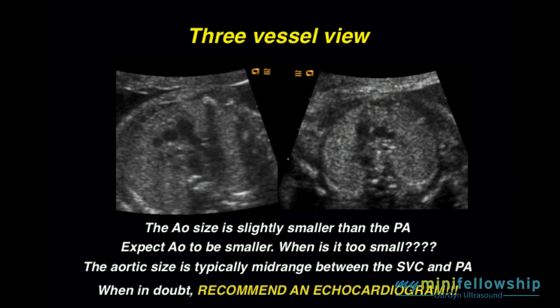Again, I cannot overstress this. If you're sitting there thinking, gee, is that aorta too small? Pick up the dictaphone and recommend an echocardiogram.